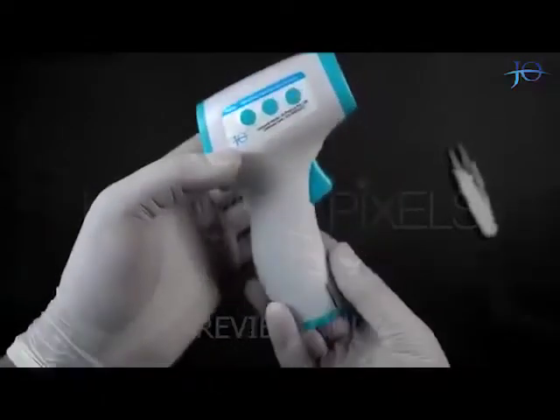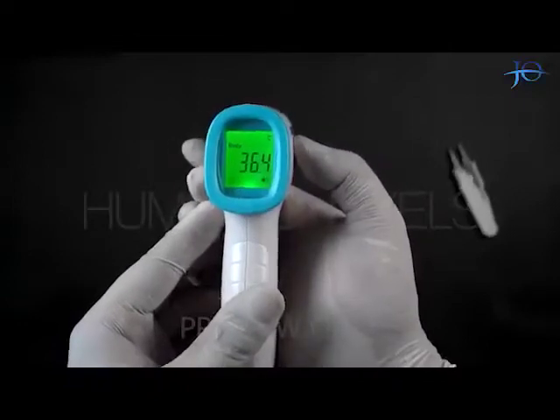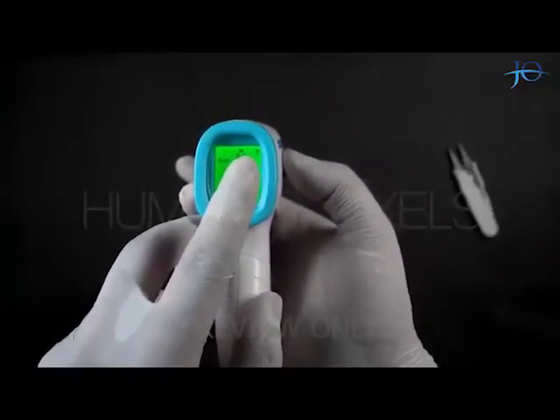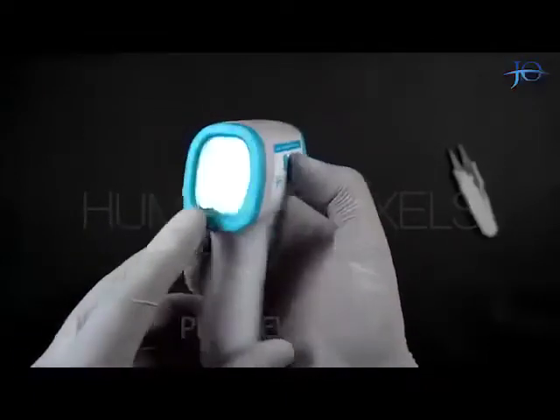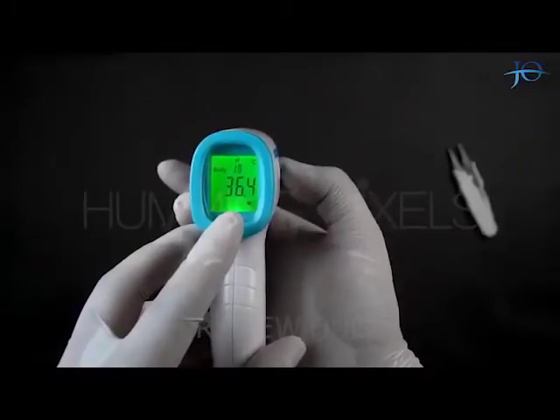Now we will see how the other buttons work. If we press the Set button, we can change the temperature unit from Celsius to Fahrenheit and vice versa. There is another button in the middle which is for memory of the temperature readings taken by the gun, showing us the last 20 readings.